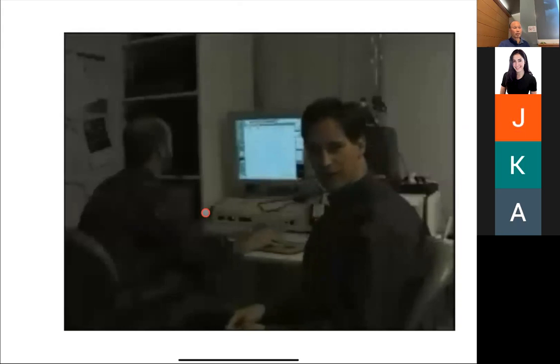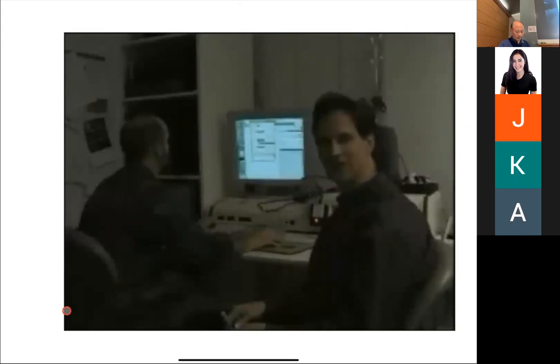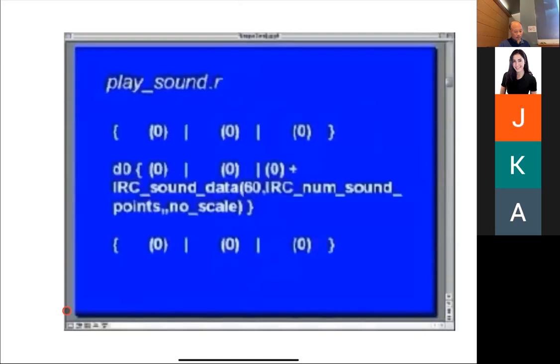Continuing problem with fMRI is synchronization of the stimulus with the scans. Imaging Research Center has addressed this problem by requiring the gradients themselves to issue audio prompts to the subjects. Sound files can be directly recorded into the SGI. A C program is written to store the file in an array. It is then downloaded in real time into the gradient waveform memory using the pulse program shown here.